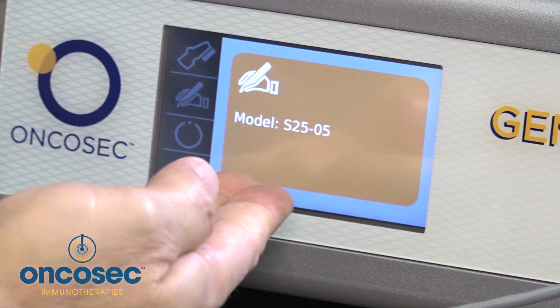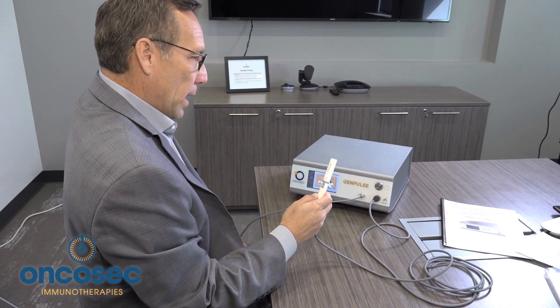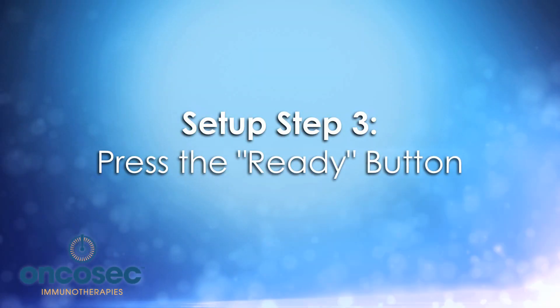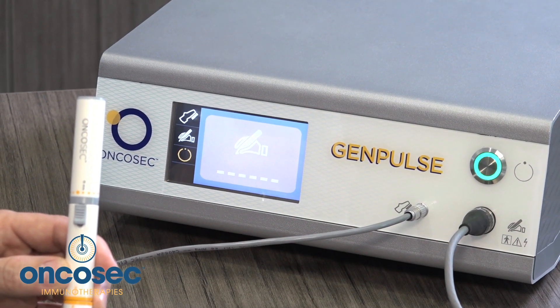The system then tells you exactly what type of model is being used. Once the applicator model has been recognized, you press the ready button. Once you press the ready button, the applicator is ready for therapy.